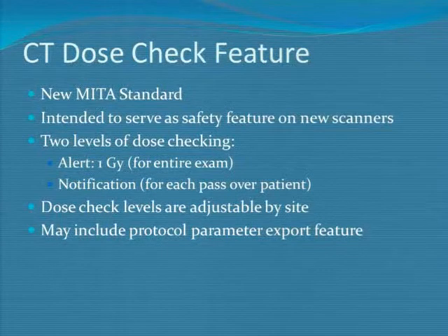But at least we've just started to get into this, and you can set it up for the bolus tracking piece, for every single helical run, for every axial run, for pretty much every piece of an exam. Some of these include some kind of protocol parameter export feature. So this might be another way to get a handle on what's set up on that scanner that you can actually pull into maybe an Excel spreadsheet or stick it on your thumb drive or something like that. They don't all have this, but several of them do seem to have incorporated that.